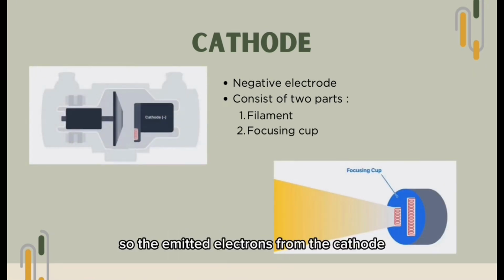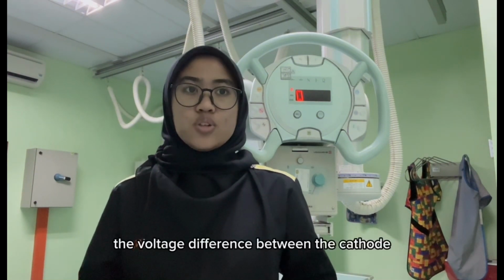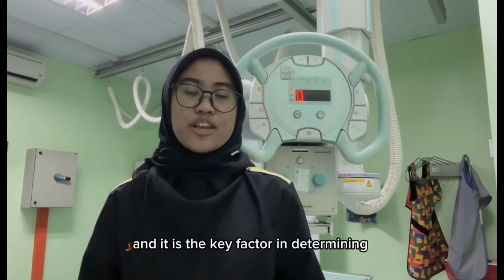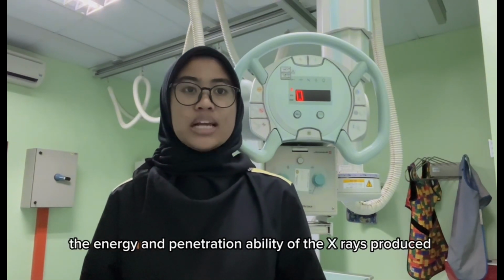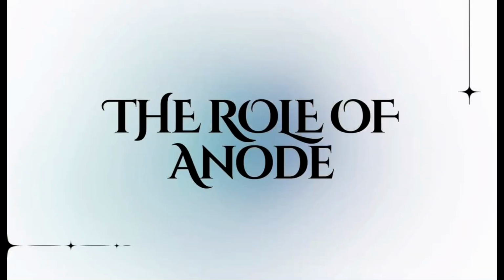So the emitted electrons from the cathode are accelerated toward the anode, which is positively charged. The voltage difference between the cathode and anode is called the kV potential, and it is the key factor in determining the energy and penetration ability of the X-rays produced. So, the higher the kV, the greater the energy of the X-rays.